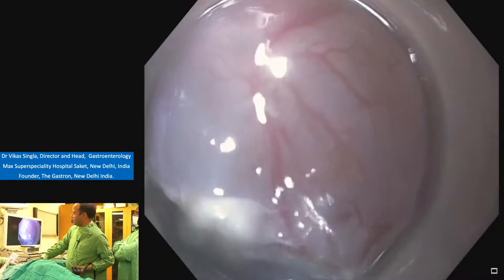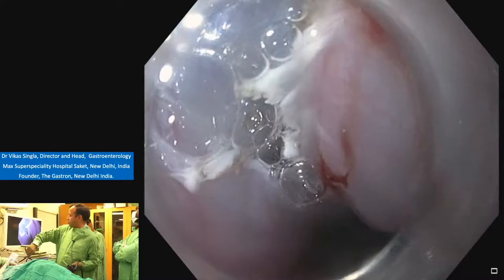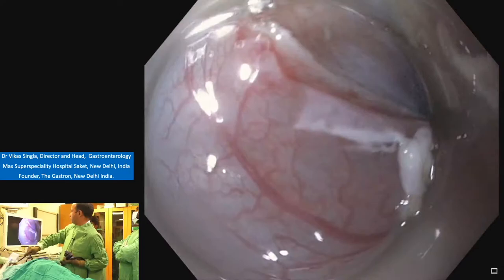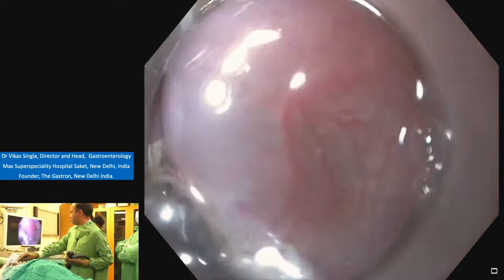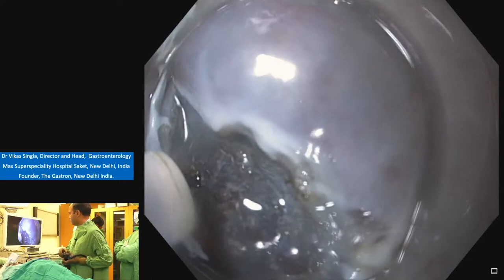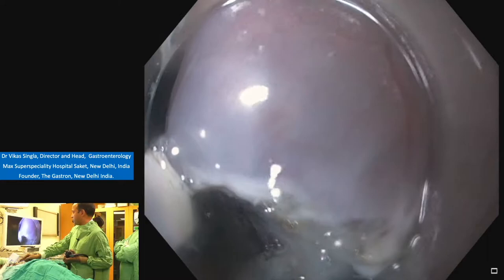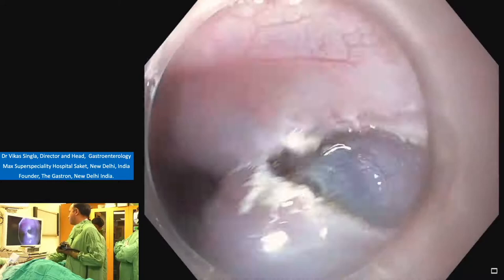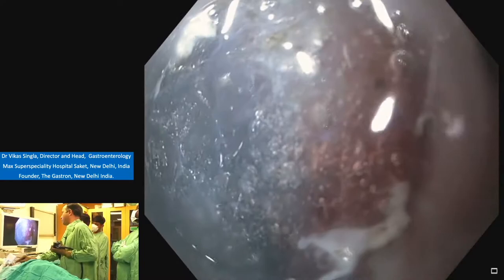Now for the entry, there is one trick. We rotate the endoscope and bring it to 12 o'clock, and then we engage both the margins. I think we have to do more dissection to inject there. Again, clearing the fiber on the apex. Again, we can try to engage both the margins. Yes, now glide and we can enter. Now we are inside the channel.